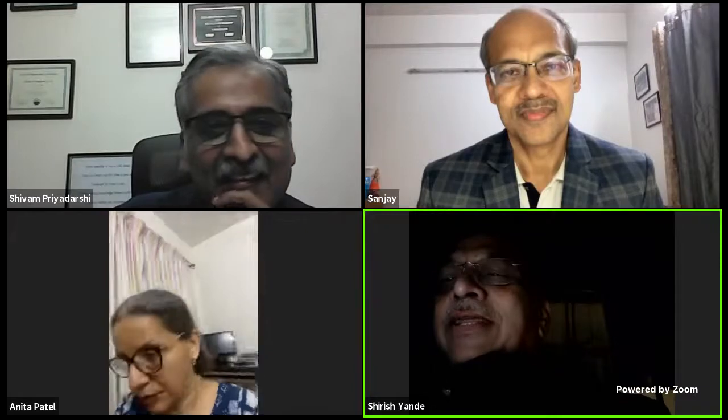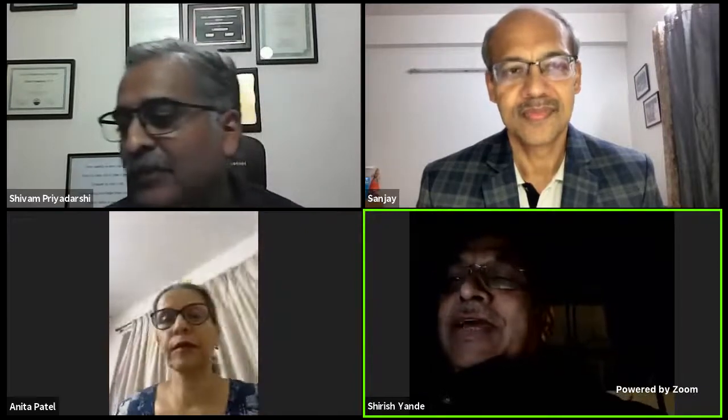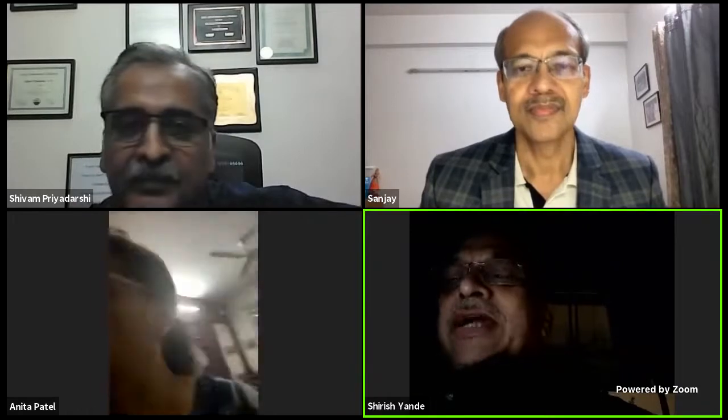Okay, I think that's a very broad question to answer. But urodynamics is done in our institution at the request of the referring physicians, clinicians, usually urologists and gynecologists, essentially. Really speaking, I do understand that not all patients who come to us actually need urodynamics.